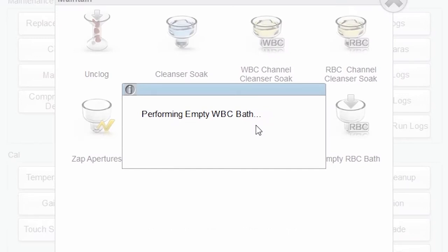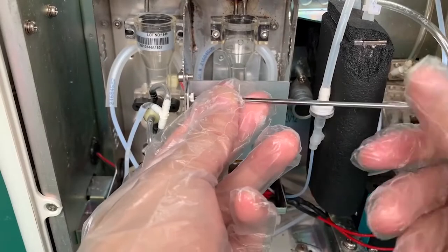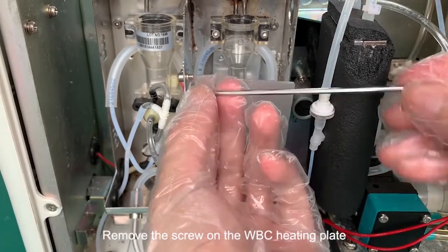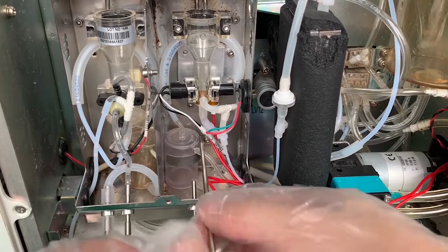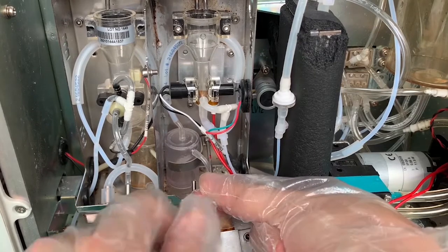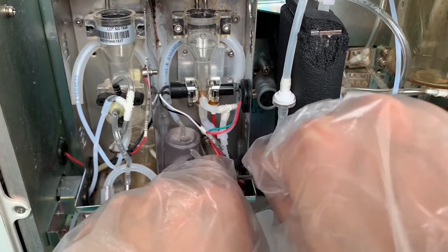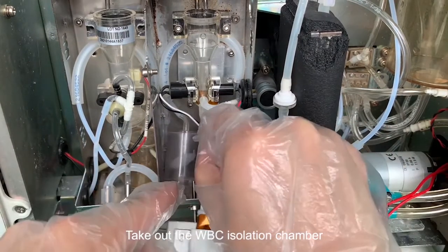Click empty WBC bath. Don't click OK. The next procedure is replacing the WBC isolation chamber. Remove the screw on the WBC heating plate. Loosen the screw under the WBC chamber. Take out the WBC isolation chamber.